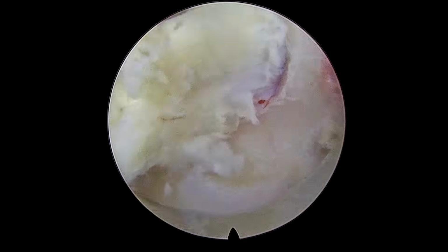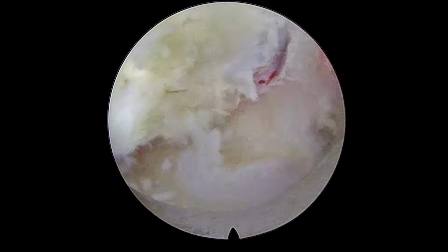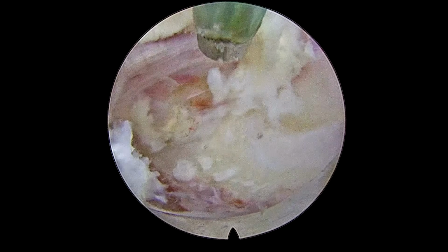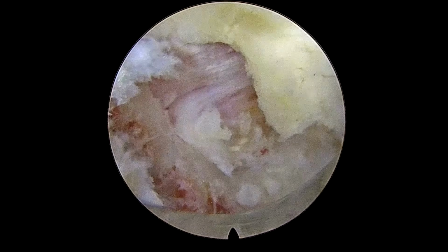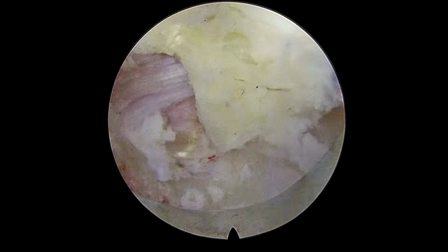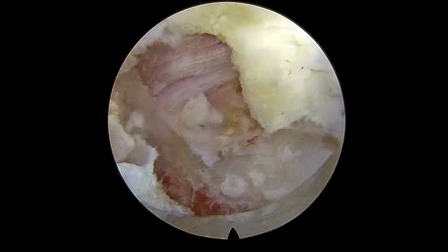You can see here we have detached the superior margin and the inferior margin of the ligamentum flavum. At this point using a burr is actually very dangerous. Sometimes the structures get entangled in the burr. So you have to be very careful while using the burr at this time when the ligamentum flavum is already detached. You can see here this is the superior free margin of the ligamentum flavum, which is detached from the upper margin.